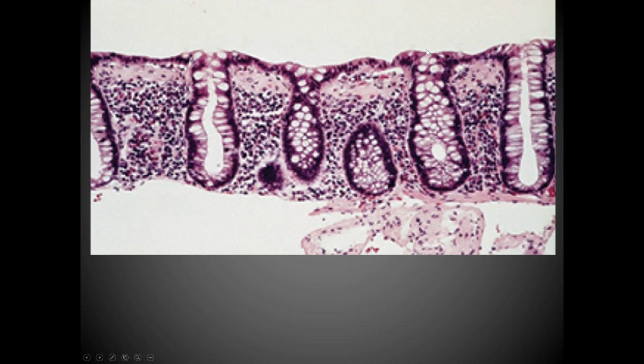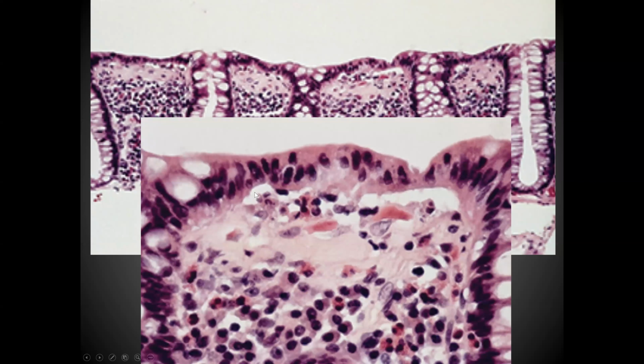And here, you won't see as much over the crypts directly, but in between the crypts, you should see some degree of loss of cytoplasm. That can be seen nicely here, where you see these cells have been shortened a little bit. There is a little bit of neutrophilic deposition here. You may see some pycnosis, like here, some apoptosis, separation along this cleft. And that's indicative of surface epithelial damage. And therefore, this qualifies nicely as collagenous colitis.